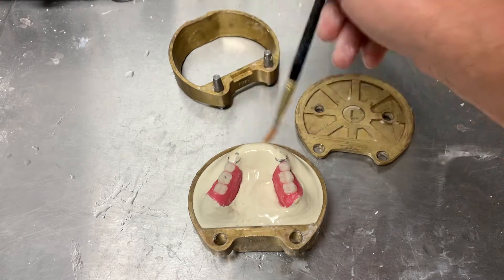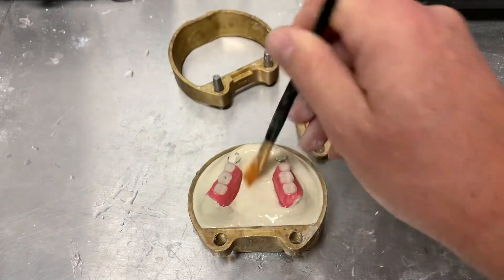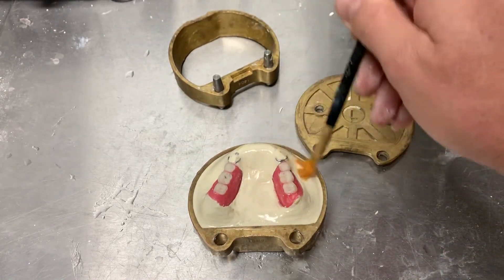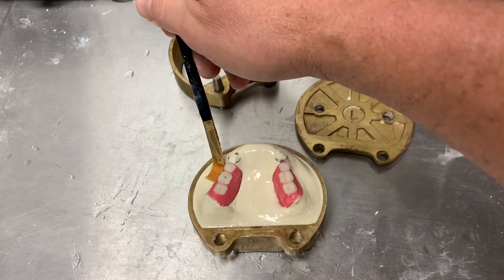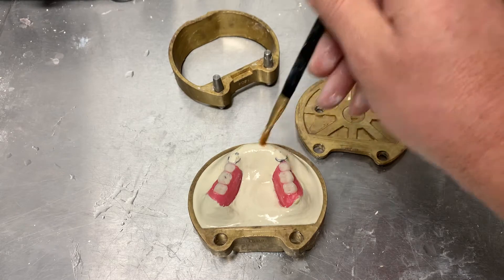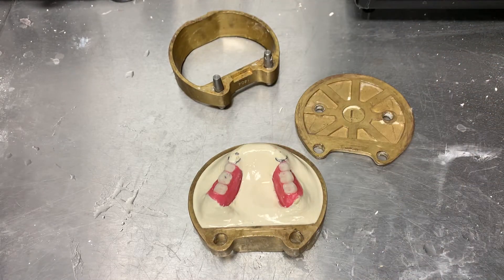You could use Vaseline or water glass — sodium silicate — to separate gypsum materials from one layer to the next. But be careful not to get any on the teeth. No Vaseline, no water glass, nothing on the teeth. Keep them nice and clean. Make sure the flasks can close.